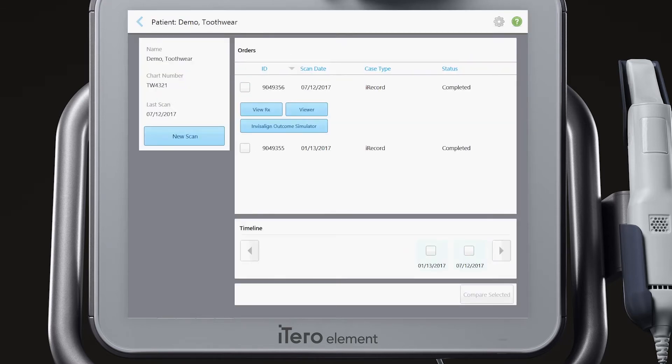Check the boxes of the two relevant case dates from the timeline, then tap Compare Selected.